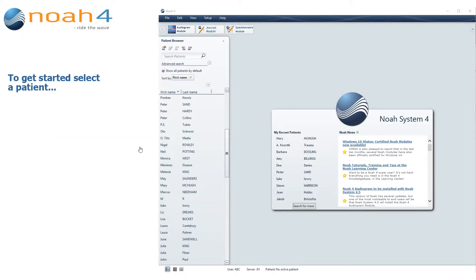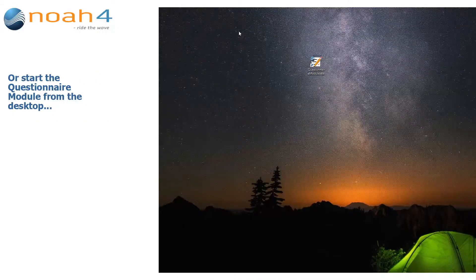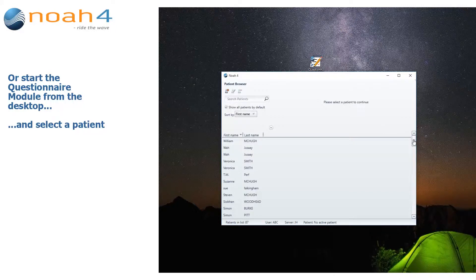To get started, select a patient, then click on the Questionnaire Module button in the Module Selection bar. Alternatively, you can start the Questionnaire Module directly from your desktop by simply double-clicking on the Module Desktop icon. Once you choose a patient, you are ready to go to work.